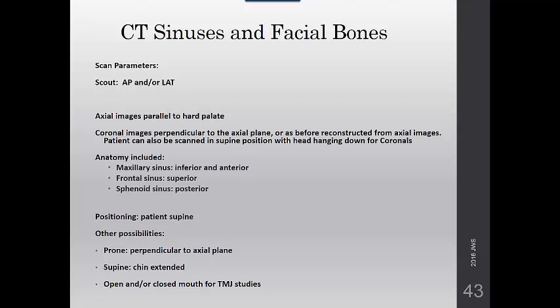CT sinus screening is intended as an inexpensive, accurate, and low radiation dose method for confirming the presence of inflammatory sinonasal disease. If confirmed in the patient, then they'll have an endoscopic sinus surgery, and the coronal images can sometimes provide a roadmap for the surgeon. When the clinical indication is recurrent or chronic sinusitis, the study is done without IV contrast.